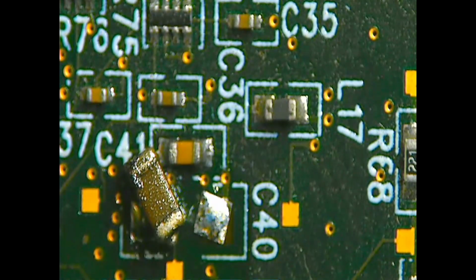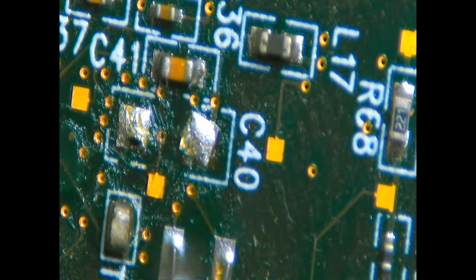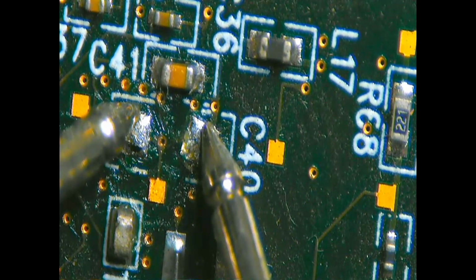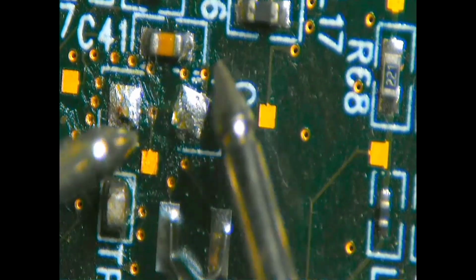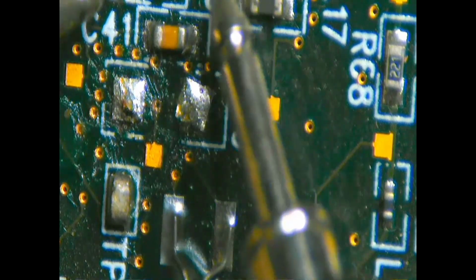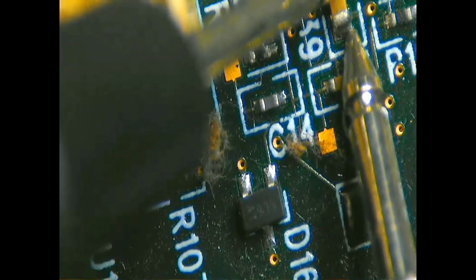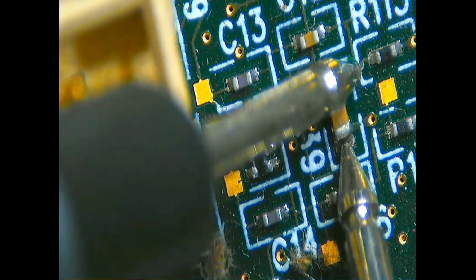Okay, we removed the capacitor. After removing this capacitor, let's see the values. It is not showing any continuity, but before it was showing continuity. And here 264, which is fine, and 675, which is fine, and 264, which is fine.